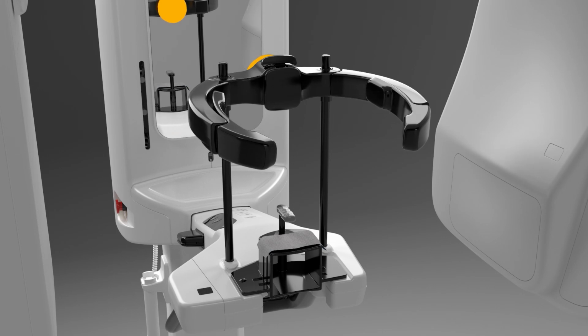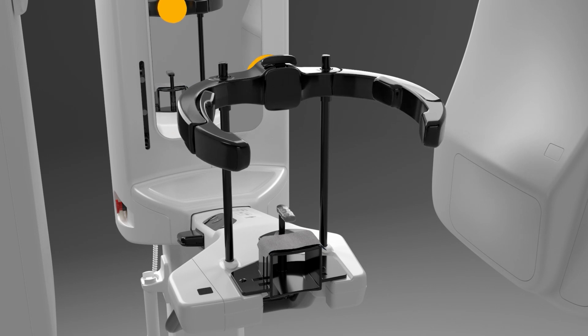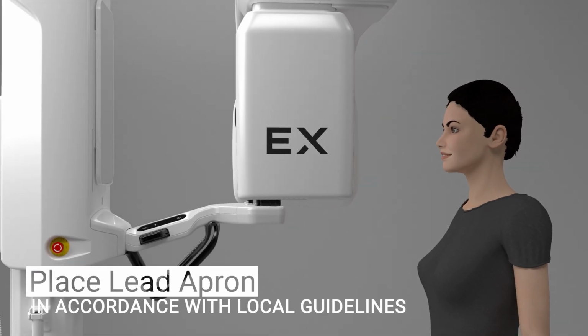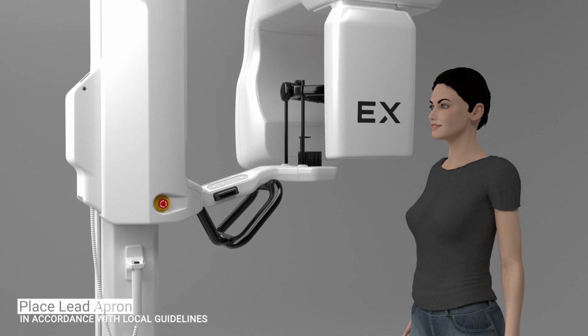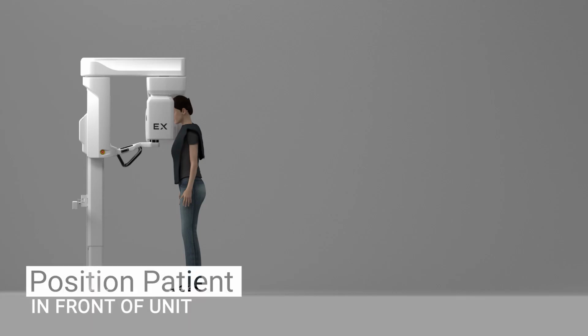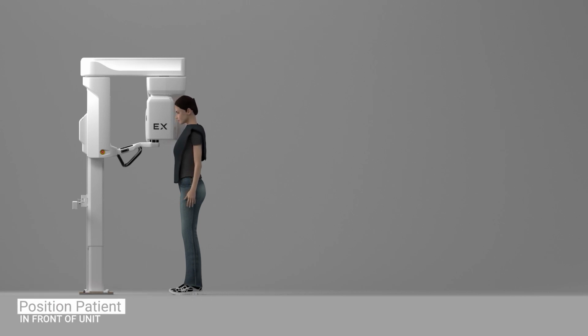Prepare the patient for the procedure by asking the patient to remove all metal objects, including earrings, necklaces, glasses, hairpins, and all removable appliances from above their shoulders. Properly place a protective lead apron over the patient in accordance with local regulations. Have the patient stand in front of the unit. Instruct the patient to stand as straight and tall as possible.